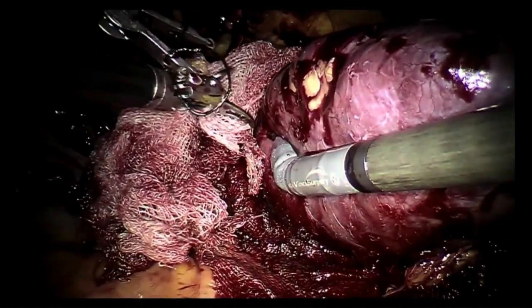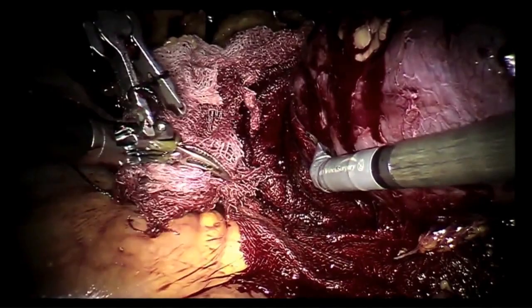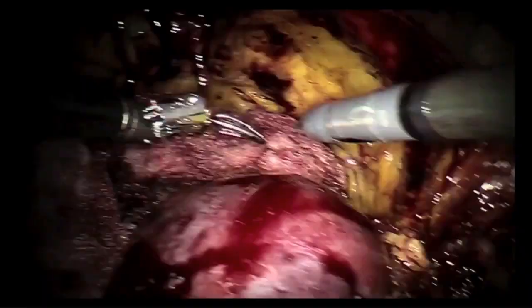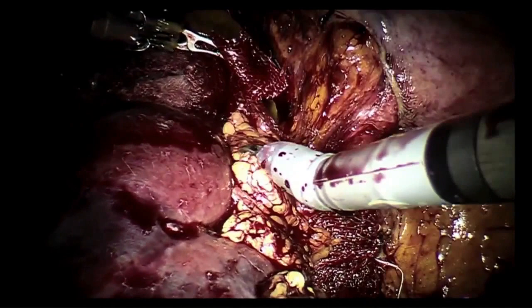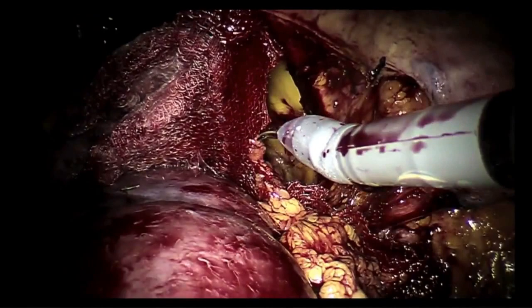This is the 12th. What? The 12th case you have done? This is 12 plus 1. How about that? This is actually harder than the anastomosis. Great stuff. Thank you. That is the ureter right there.